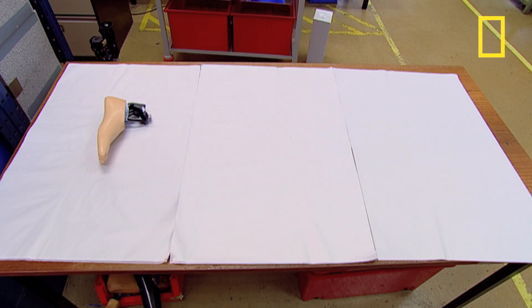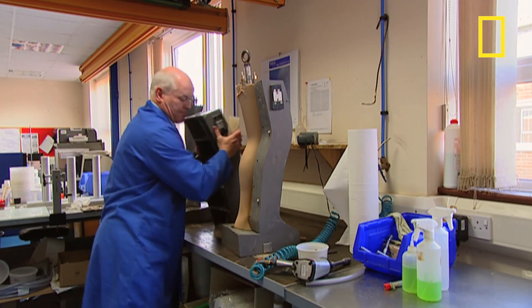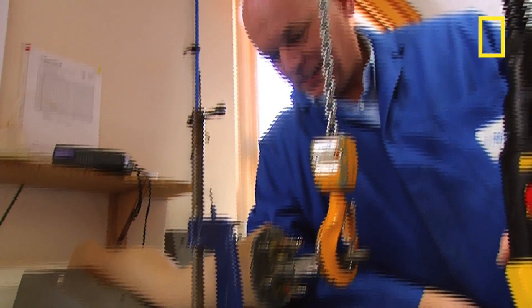A perfect fit every time. And for those who don't wear trousers, here's where they make the skin. It's a silicon compound available in eight different shades and carefully tailored to mask the joins.